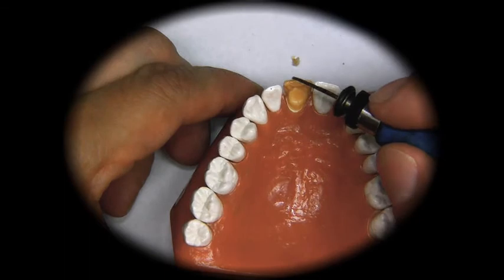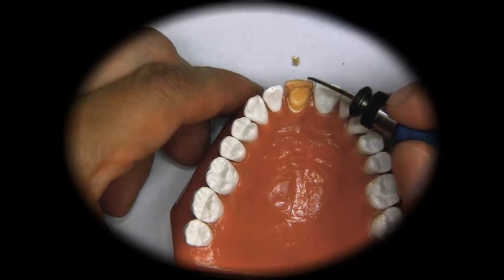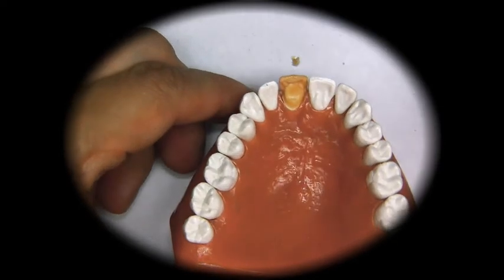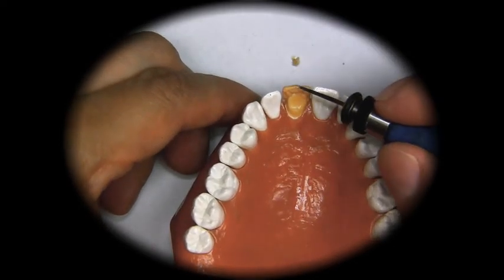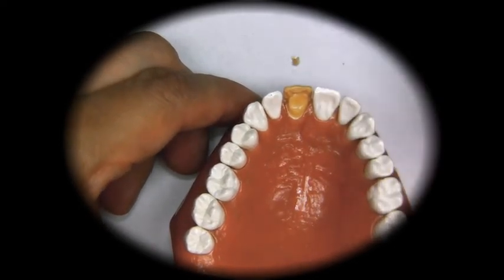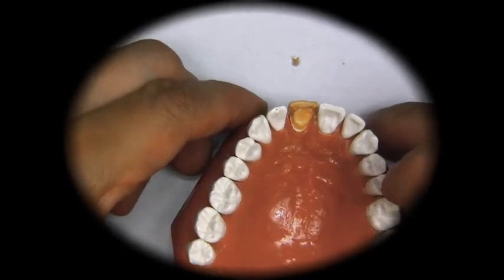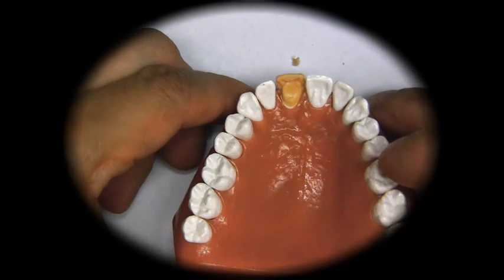Then we can add a little bit to other places where we think might need a little bit more to make it look more similar to number 9. Now right now we're only working on the facial surface.